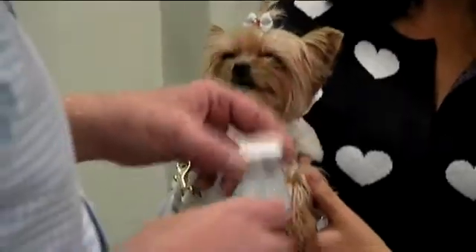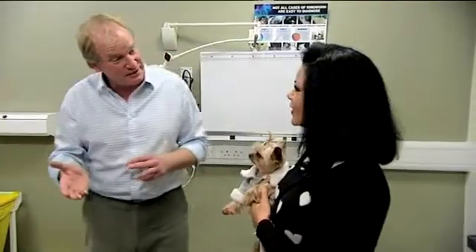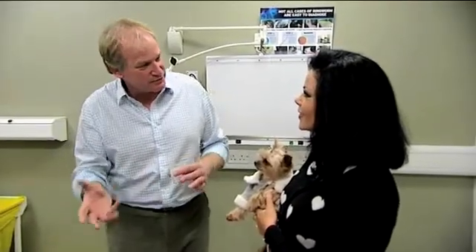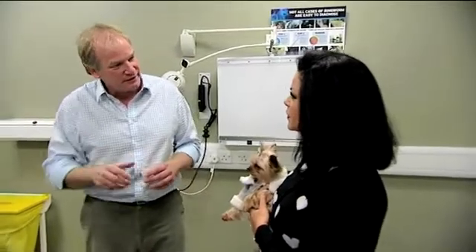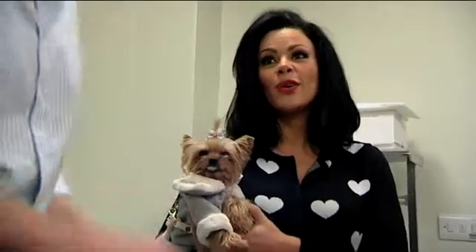I just literally let her crouch down and popped the pot underneath and collected as much as I could. Although here we've got a specific specimen sample, you could use anything — you could use a jam jar, you could use a mug if you really wanted to. But this was perfect. And obviously with a cat it's even easier, because you can use special cat litter to collect their urine, so you don't have to follow them around. She's the size of a cat but we have no litter, so we were following.